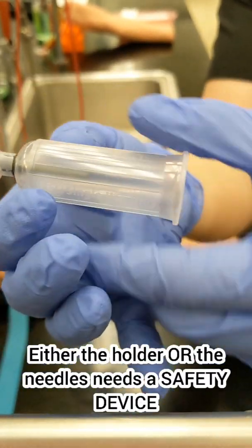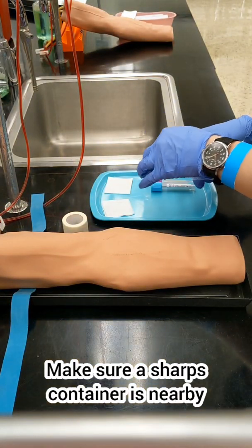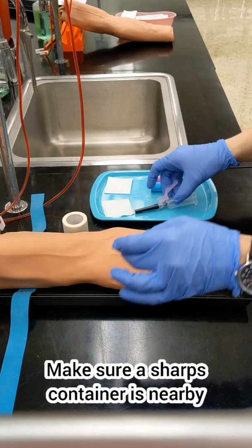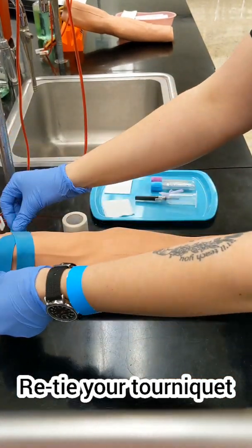A quick note: wait for the alcohol to dry to prevent pain when you insert the needle and to prevent contamination. Remember to not remove that needle cap until you are ready to go into the vein — you don't want a needle just kind of hanging around.